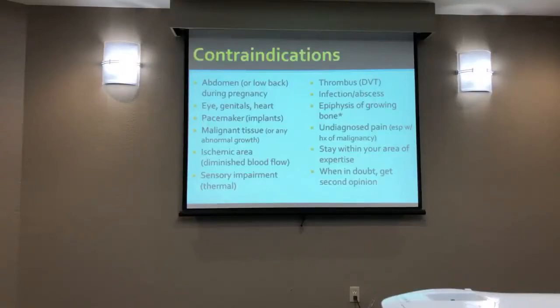Has anyone actually looked at the research at the cellular level of just heating through exercise and compared it to the ultrasound heating? And if it's the same, then why are we doing this? No, I agree with you. I work in a neuro facility. I rarely do ultrasound either, but when I do, it's for heat and stretch purposes, simply because that's the patient population I treat.